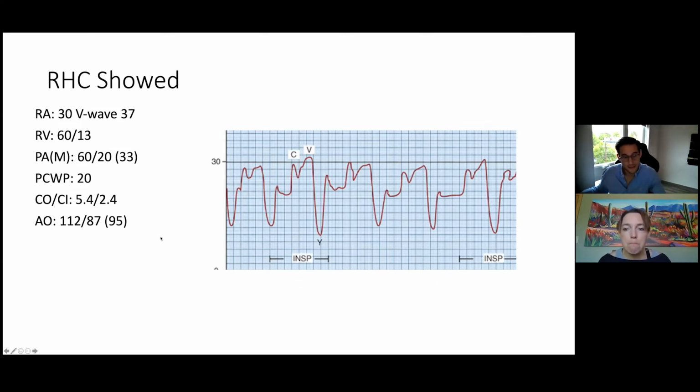Thermo, yeah. Yep. And yes, but a few things that we see here, right? Do we want to say a few things? Yeah. So what do you think of these numbers? Yeah, this person, first thing I would say, right? The wedge is high for sure, and her CVP is high inclusively, I would say.